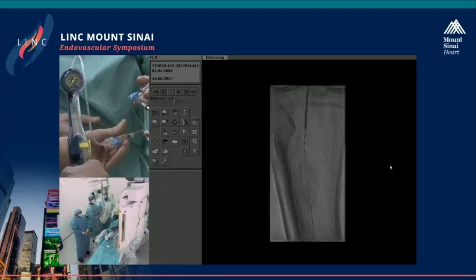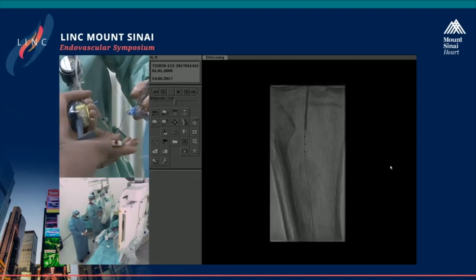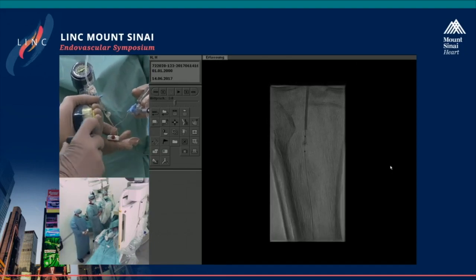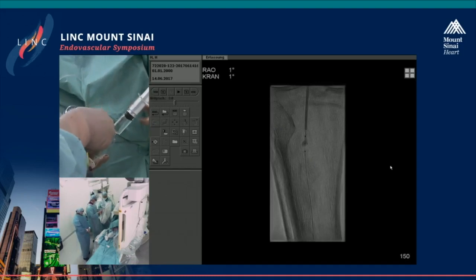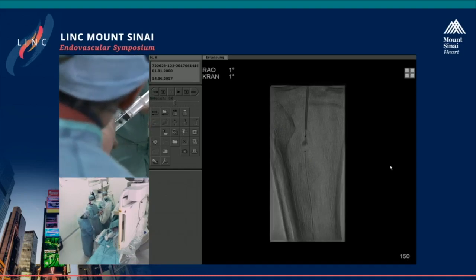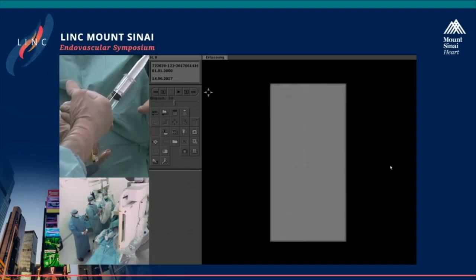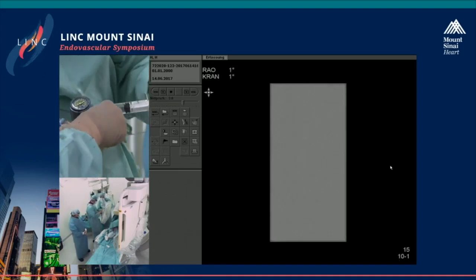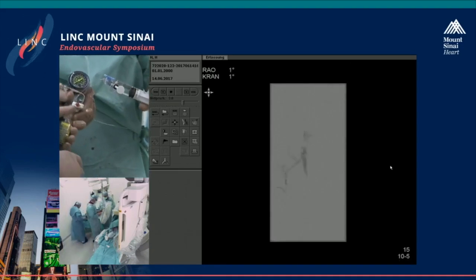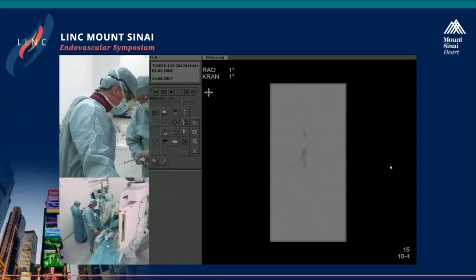It's kind of a dose-finding study, which is actually ongoing here in the United States with 60 patients, to deliver sirolimus actually into the adventitia, which with a classic drug-coated balloon has been very difficult. It's too small. So I think it's interesting. And in theory, going further, you may even be able to use drug combinations. So I think it's really a method of delivering drug what we are showing here, and that's why we find that also very appealing.